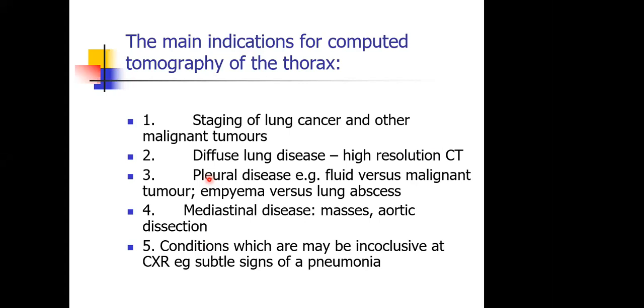Sometimes on a plain radiograph, we can't easily differentiate them, but once we use computed tomography, we are able to differentiate the two. Empyema versus lung abscesses. Again, sometimes we have that dilemma when we are looking at plain radiographs. So it's a very useful modality in that area.